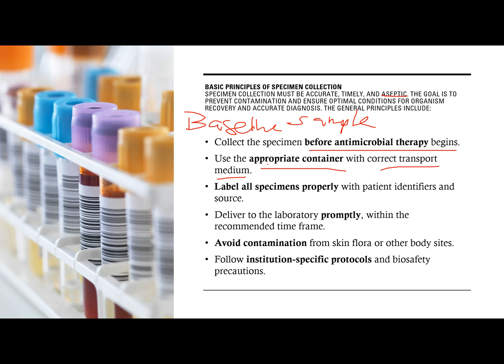Then, the third rule, class. So, ito ang pinakamalaking kasalanan ng medtech: mislabeling. It's the greatest sin of all medtechs, class, and even in the healthcare profession. So, as medical technologists, you need to make sure that all of your samples are labeled properly with patient identifiers and source.